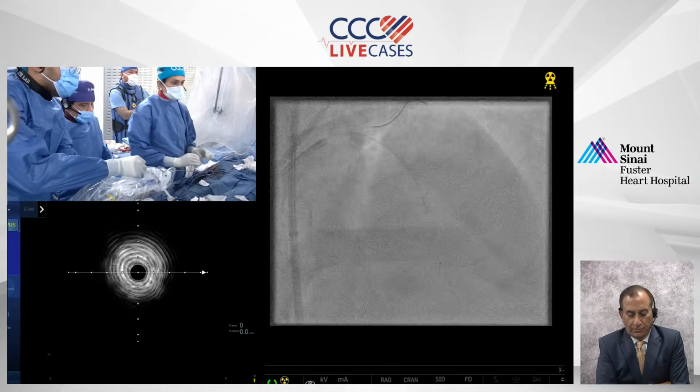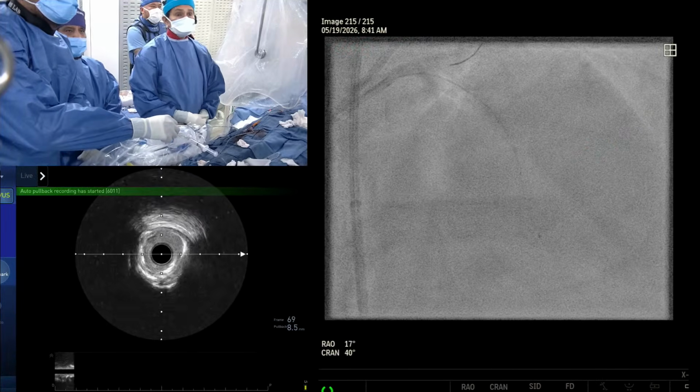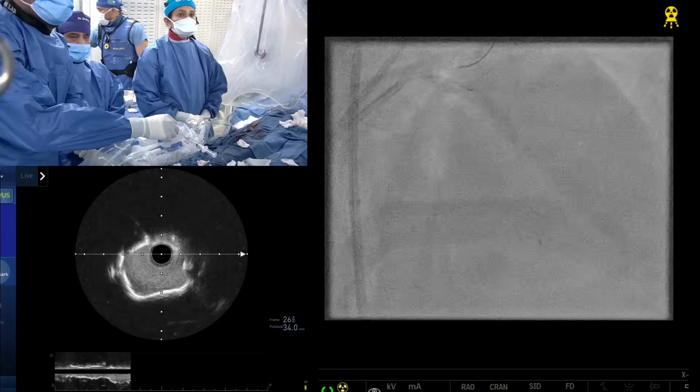I can tell you there are some data on maximum pulses versus selective pulses, when your balloon is fully expanded. Maximum pulses have been shown to give a better outcome. But usually once your stent is fully expanded and you are done two times in that area, I think that's good enough.